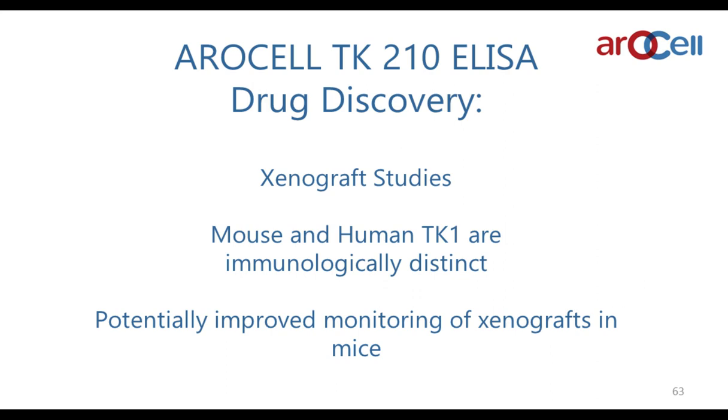Following studies in microtiter plates, the next step is to look at xenograft studies. And here's an advantage of ELISA compared to enzyme activity assays, because mouse and human TK1 are immunologically distinct. So you could potentially get improved monitoring of xenografts in mice. We are performing studies on this, and if you've got any studies in this field, we'd be very pleased to hear from you.